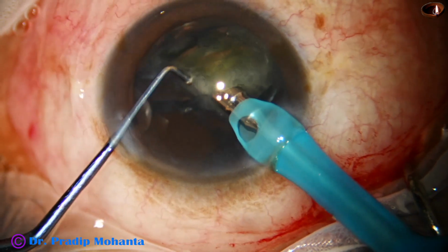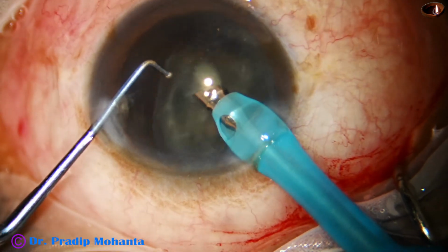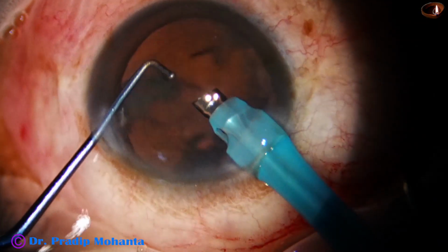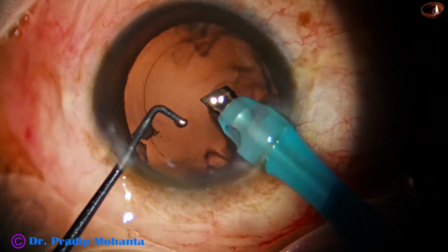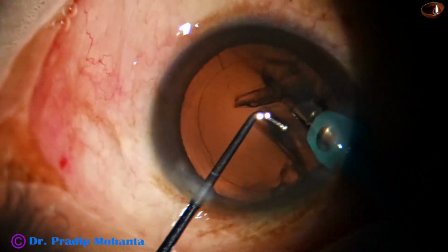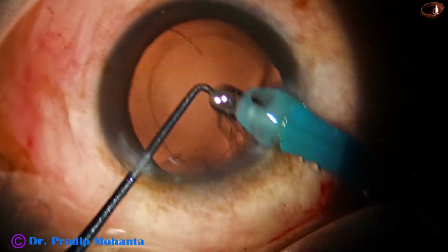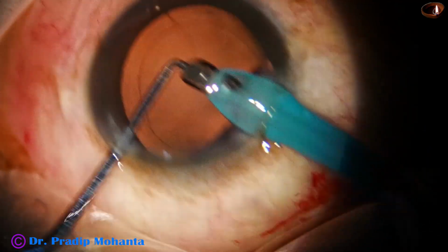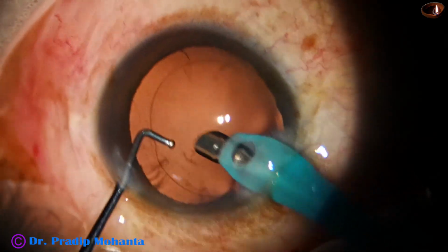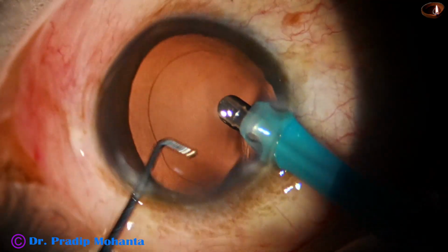And nowadays I usually use the Phaco needle to remove a lot of cortex. A little bit of cortex remains which can be removed either by the Simcoe or by manual IA or coaxial IA, whatever you want. In this case, all the cortex, almost all, has been removed by the handpiece itself.